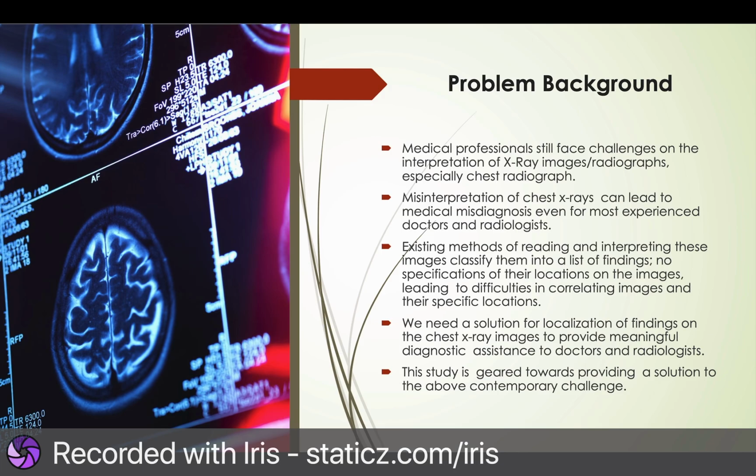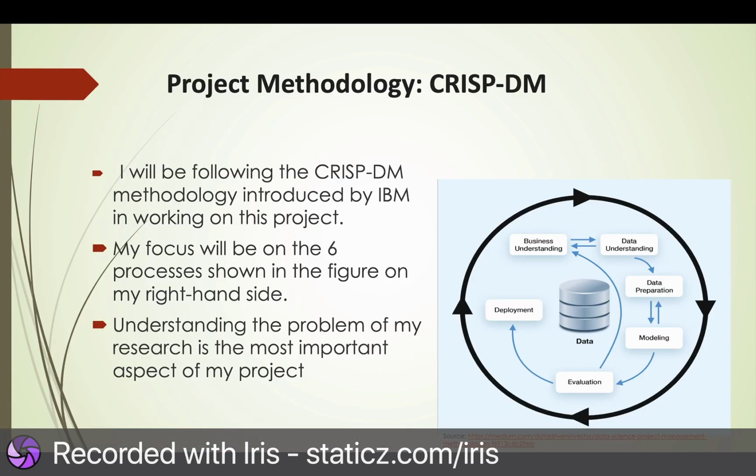It focuses on providing a solution to the above challenge, ensuring that we have an algorithm, a model, which can read these images, classify them, and localize the findings, drawing circles or even rectangles on the specific area where we have this kind of abnormality.